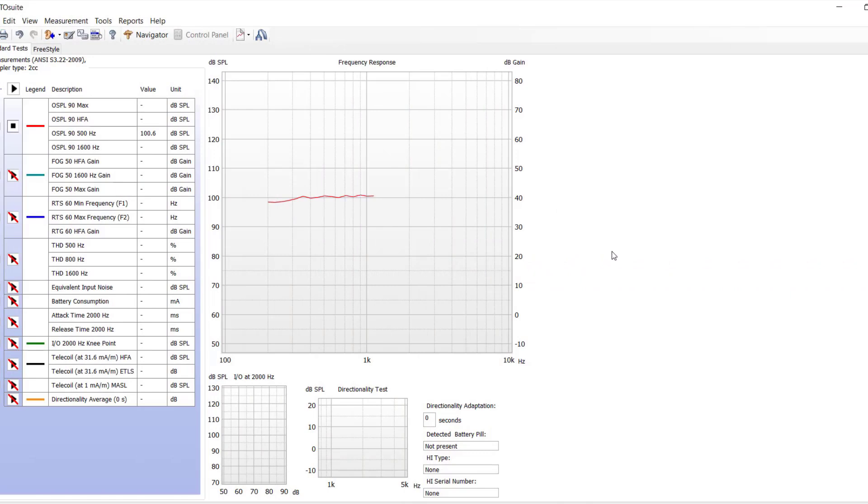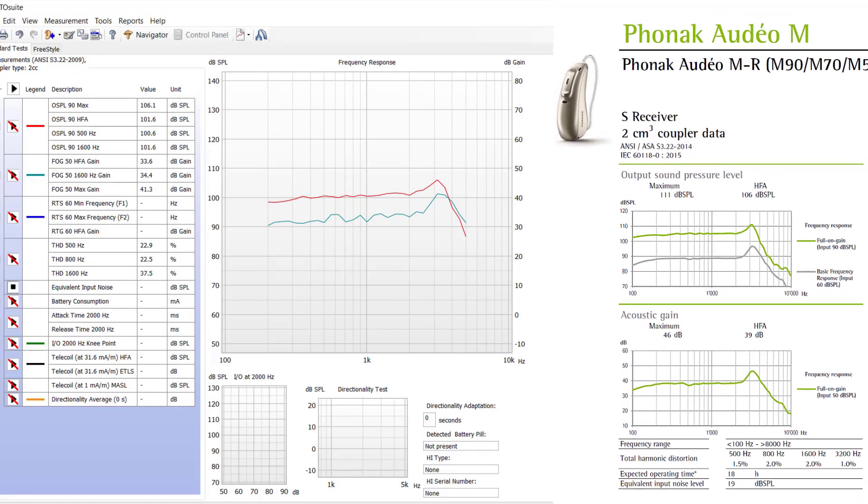I'm going to start with a hearing aid from a patient who feels their hearing performance isn't as good now as it was a few months ago. After doing a listening check on the device myself, it really sounded fine, but that prompted me to do a diagnostic check to see if there's something we could objectively measure to identify the problem. As I set up the device in the test box and ran it through the test sequence, performing full-on gain and reference test gain measures, things start off well, but some of these measures look like they could be outside of the allowed tolerance ranges. As we compare the test box measures to the manufacturer's specifications, we can start to see why the patient felt that their hearing has not been as good lately.